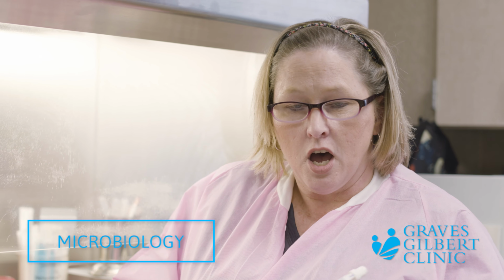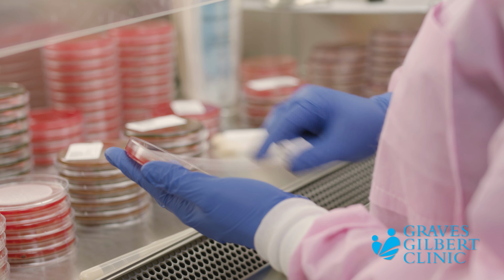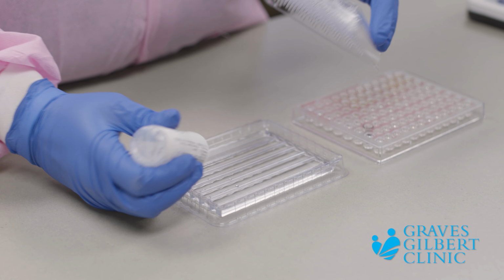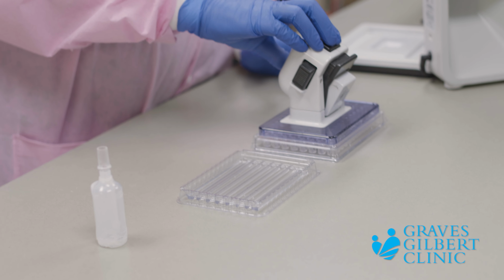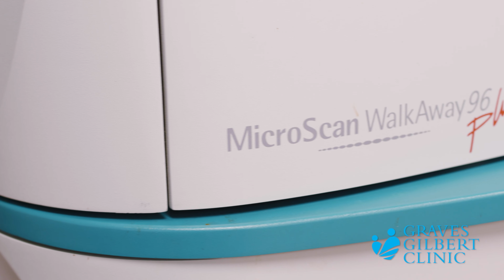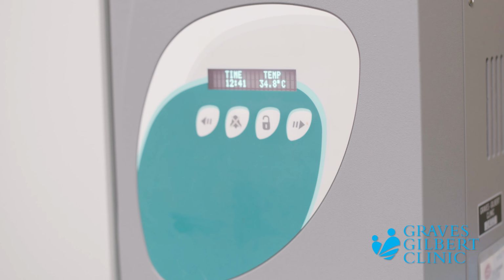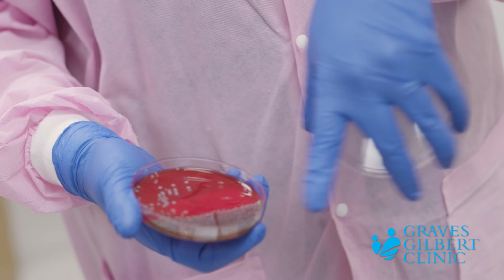So this is microbiology. We receive cultures either as a swab or as a urine or another bodily fluid. We set up the cultures and read them at 2 to 3 days to see what grows. We'll then set up a panel and determine what bacteria grows and what drug that the provider should use to treat the patient. Once we look at the plates, we put them on the panel, put the panels in the analyzer, which is a MicroScan. Tomorrow we'll come in, it should be able to tell us what bacteria it is and the drugs that it's resistant or sensitive to, and we provide that to the doctor so they can know what drug works best for them.